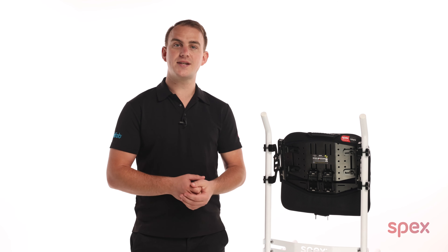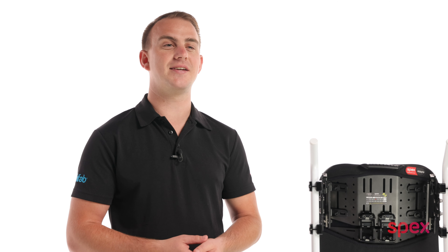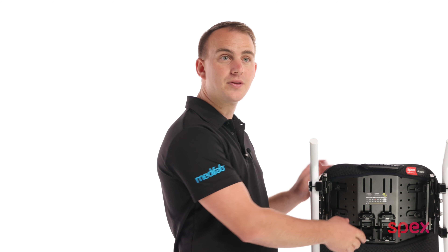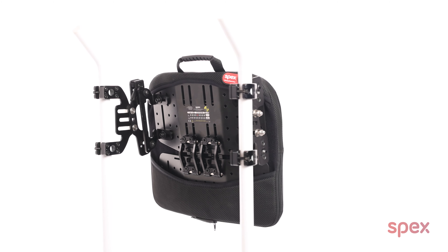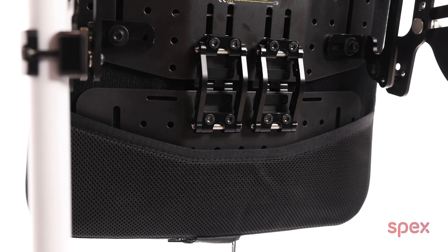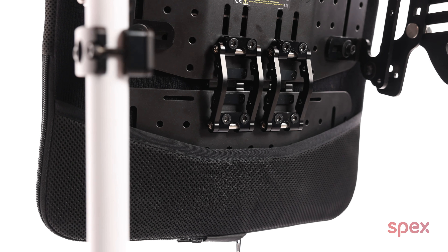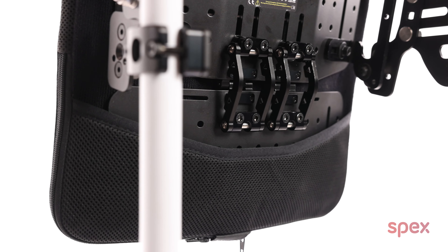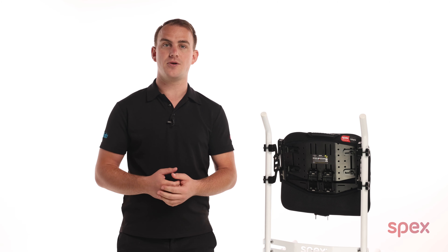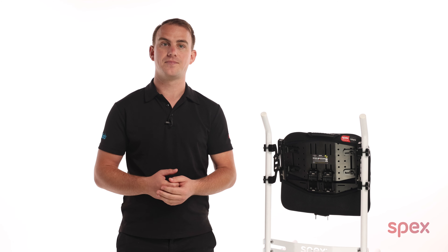Before we start adjusting the back support, I want to show you a feature I love about the adapter range. The profile curvature system is positioned at the rear of the back support, which allows for all adjustments to be made even while the client is seated, avoiding the need to transfer out of the chair.